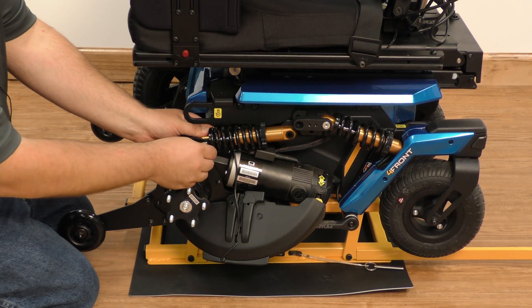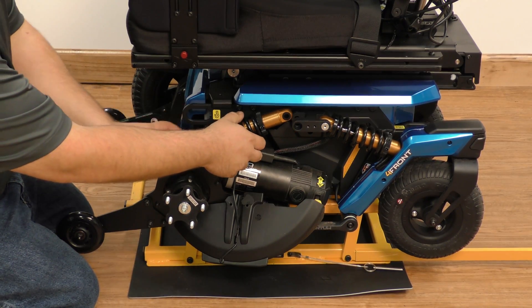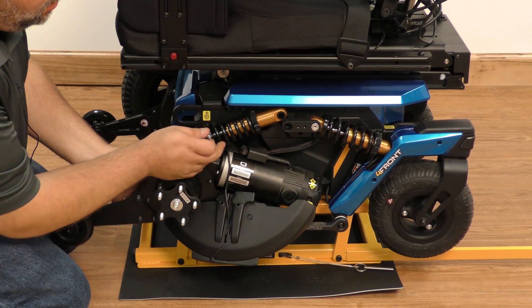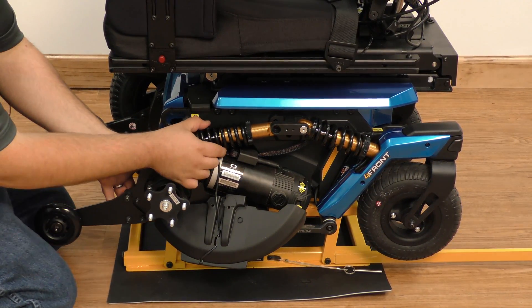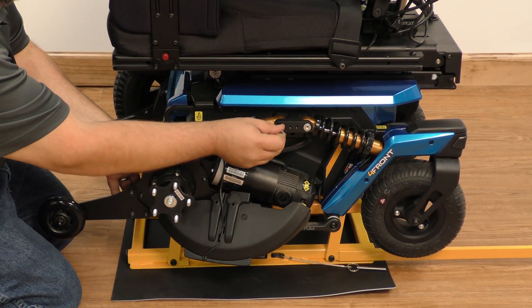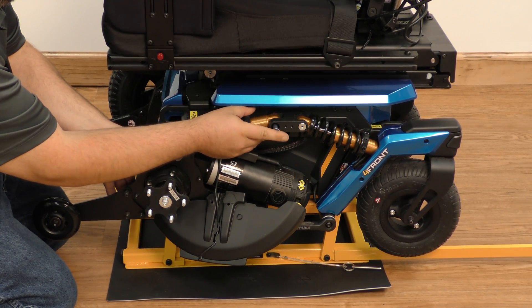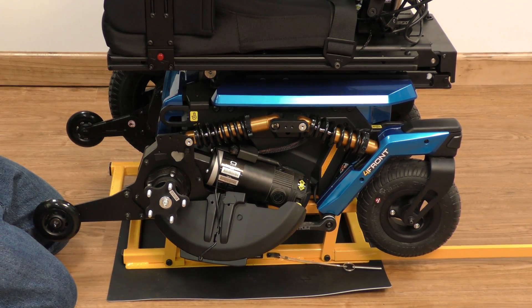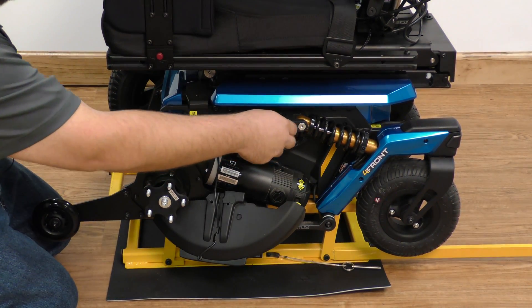We take our pin and put that right in place, then take our second pin. We have to lift up the motor mount to allow the strut to go back into the strut body, and push it right back into place. Then we take our 3mm Allen and pull that screw out.